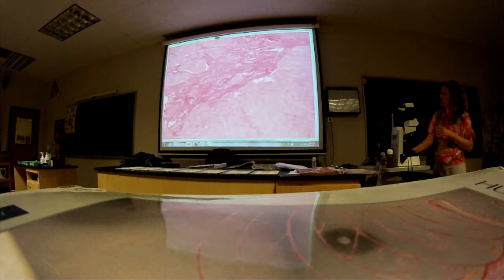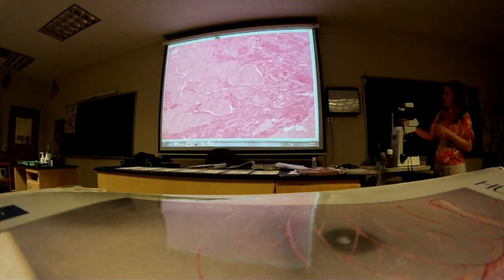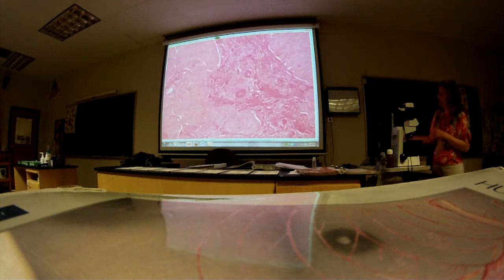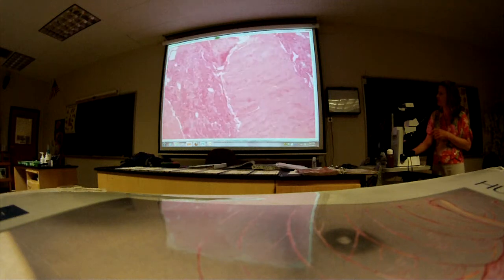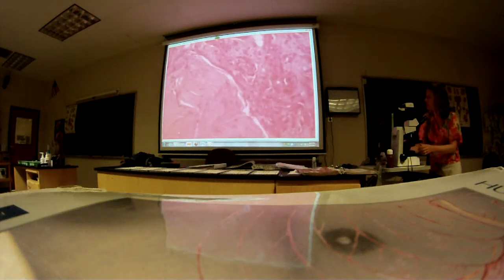So this is the collagenous sheath with all those collagen fibers, and then there's also little sprinklings of it coming into the corpus cavernosum. So not a great example. There's that artery that was in the corpus cavernosum. And so this over here, we're just getting kind of a mess of what corpus cavernosum is supposed to look like. So I don't really like this too well. Let's see if we can see this smooth muscle anywhere in here.